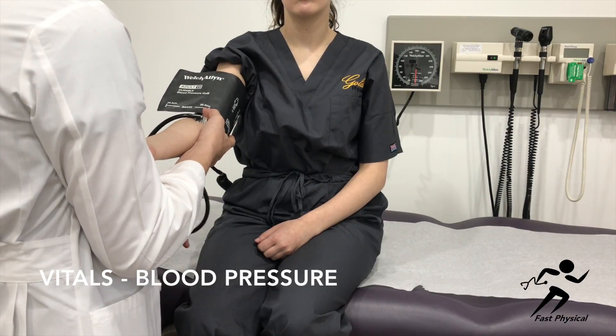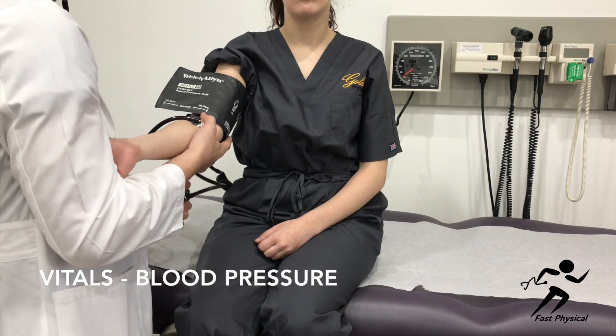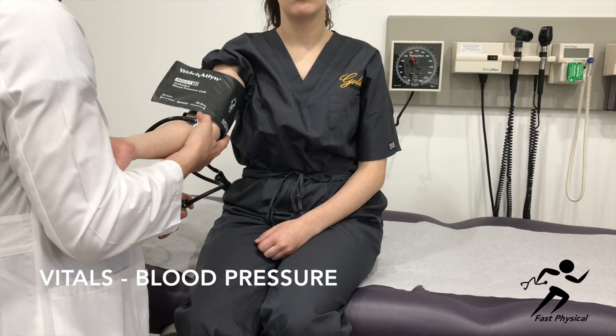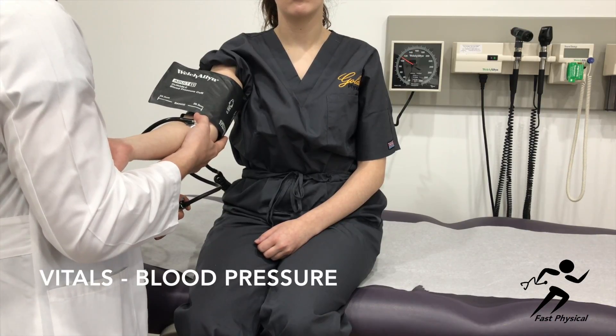Make sure to close the valve on the blood pressure cuff and begin to inflate the cuff. You want it to be approximately 20 mmHg above estimated systolic pressure. If you do not know what this is, 180 is a good place to start. Open the valve and allow the needle to fall 2-3 mmHg per second.